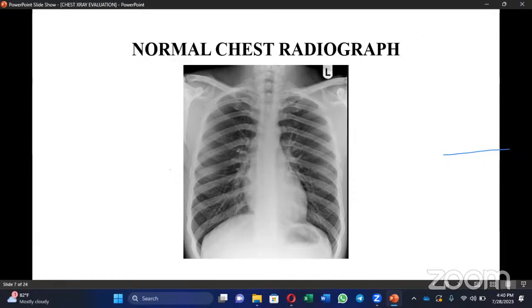So does it mean that this X-ray was taken posterior anterior, right? Yes. So I said earlier that all the images that we will see in this session are posterior anterior images, because posterior anterior images are the standard view for chest X-rays.